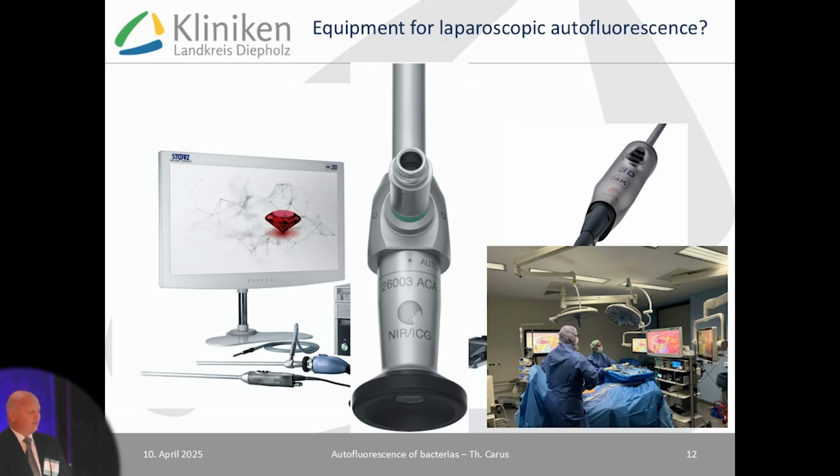But you can't see autofluorescence. For autofluorescence you need a special dual band filter, but there's no approved device on the market to use it. And therefore I had a problem. I cannot put a non-approved camera into a body to do a laparoscopy. Therefore the little trick was that I took a sample of the free fluid in an appendix perforation outside of the body and then imaged it by autofluorescence.